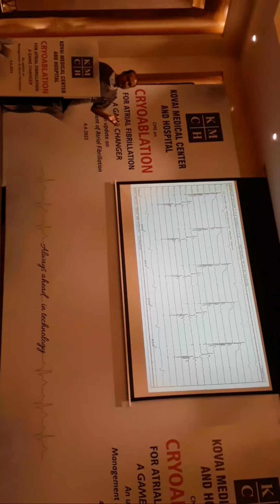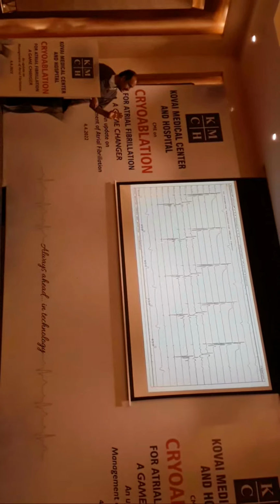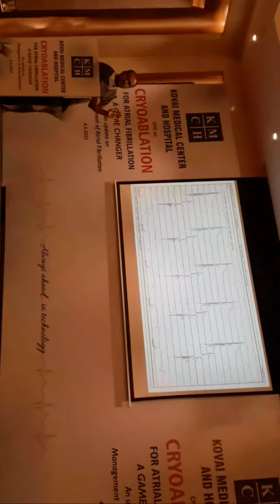So here you can see the balloon is in. We started delivering the freeze. When we started delivering the freeze, you can see the pulmonary vein potentials are getting delayed from the left atrial potential, showing that we are causing some amount of isolation of the pulmonary veins.